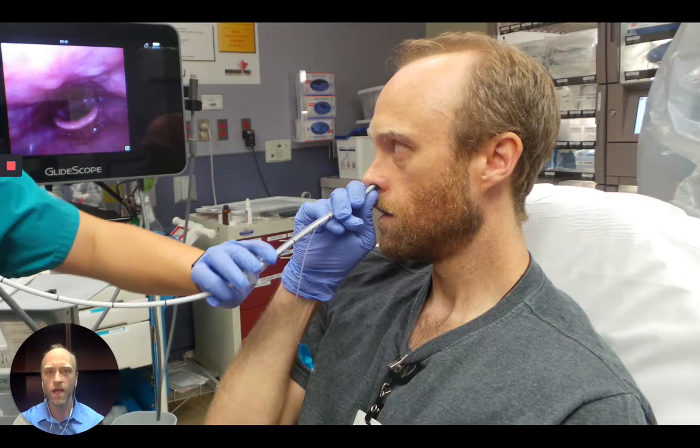Next, insert the lubricated flexible endoscope through the ET tube. The tip of the scope should be directly above the larynx as it emerges from the end of the endotracheal tube. Smoothly move the tip of the scope toward the glottic opening. So here is a video that will demonstrate that portion of the procedure.